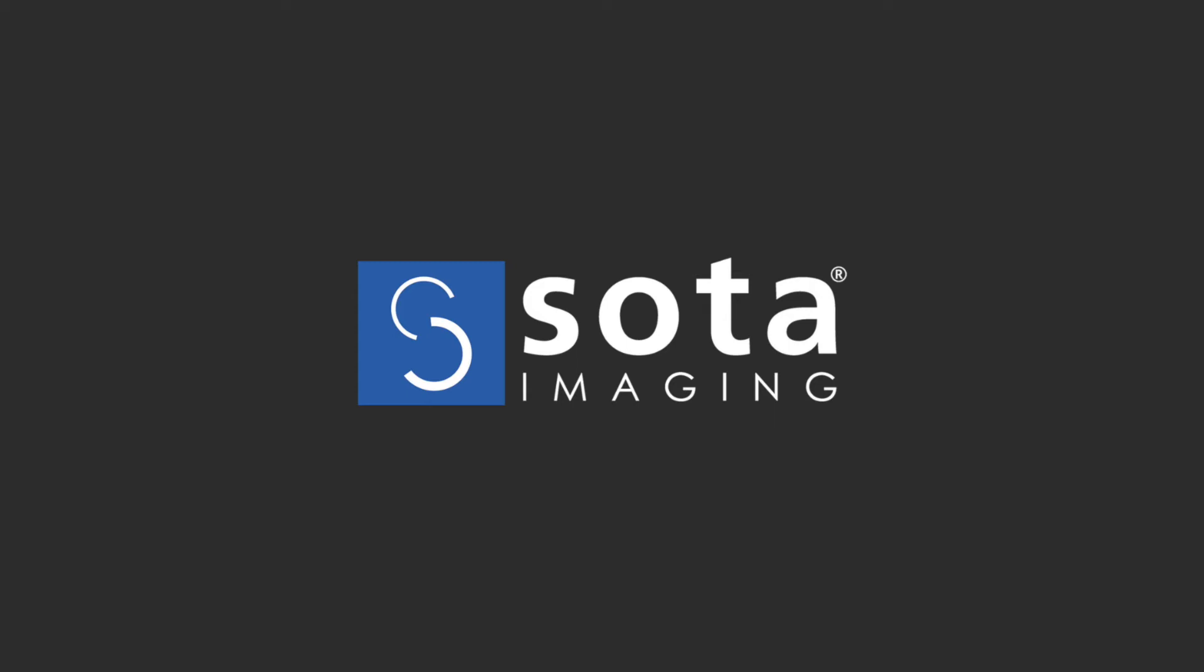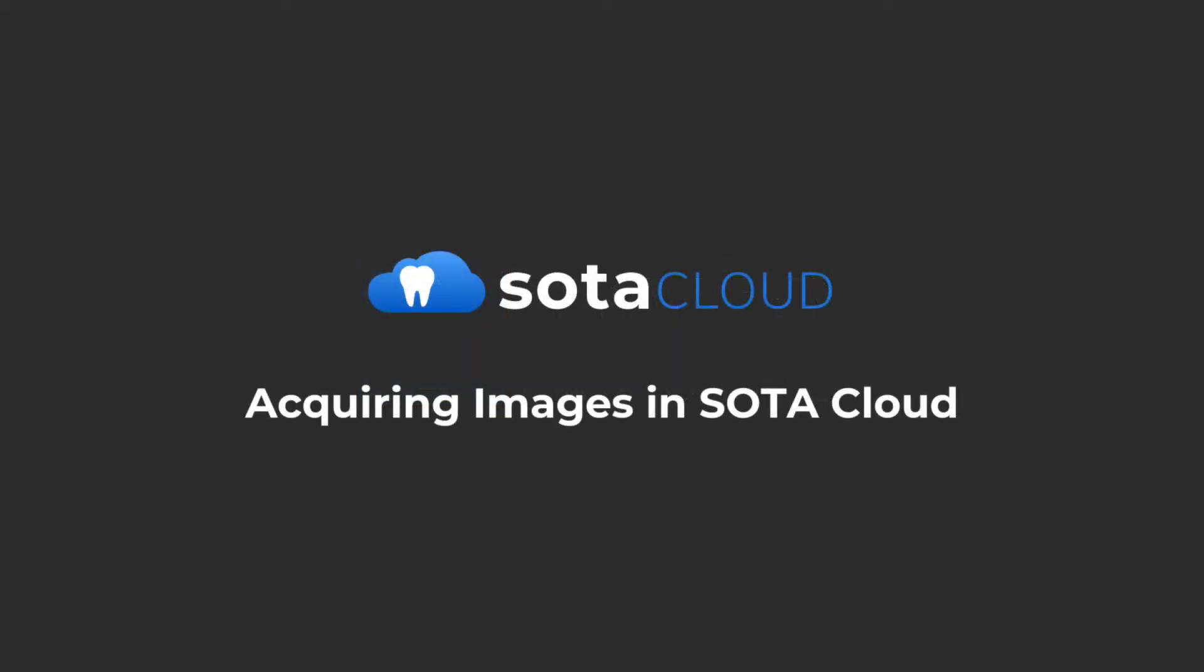Hi, my name is Dustin and I'm the Director of Engineering at SOTA Imaging. Today I'm going to demonstrate how to take an exam in SOTA Cloud.